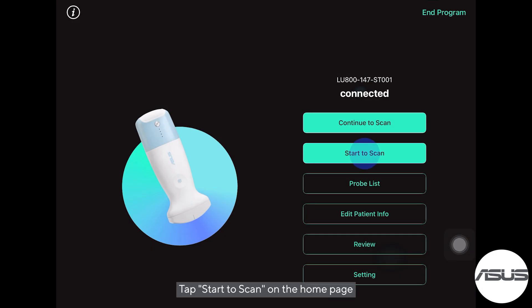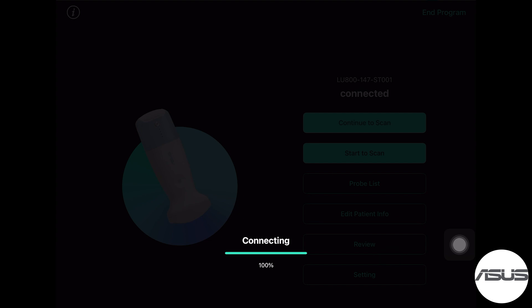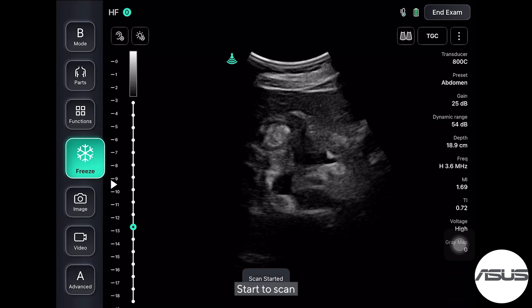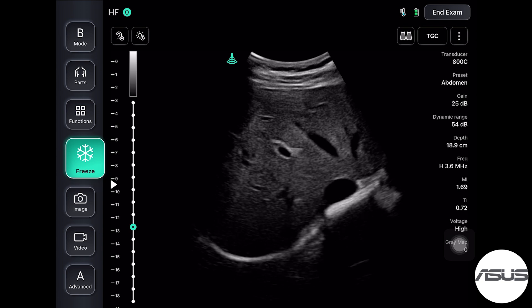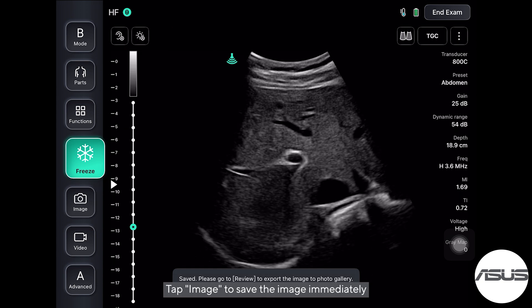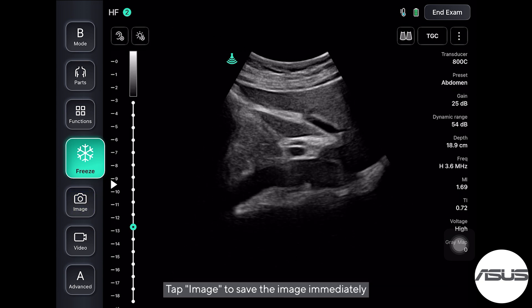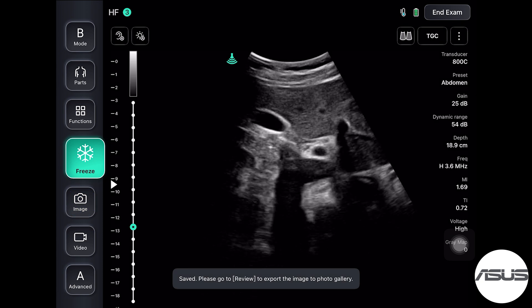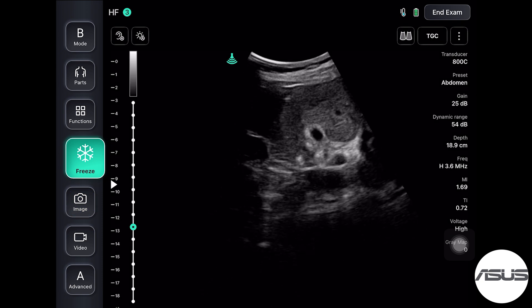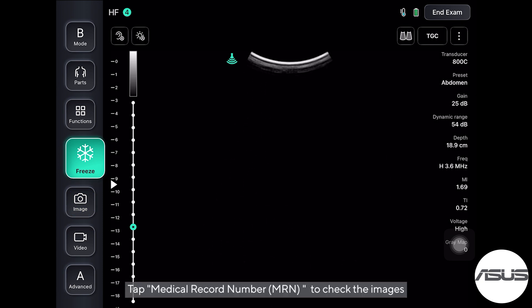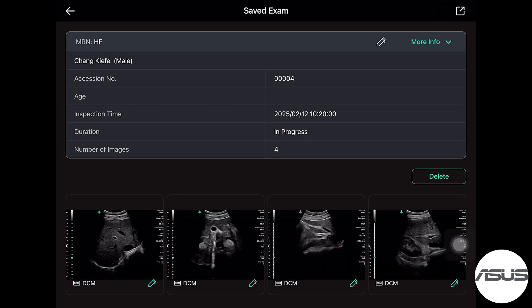Tap Start to Scan on the home page to begin scanning. Tap Image to save the image immediately. Tap the Medical Record Number (MRN) to check the saved images.